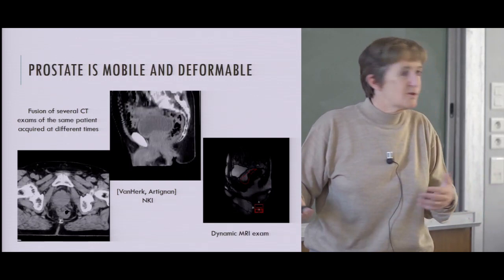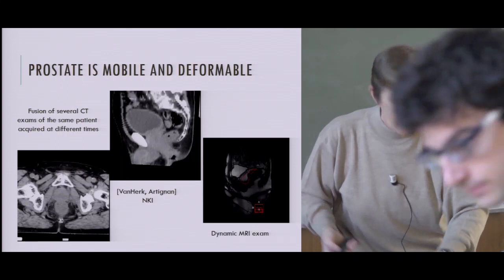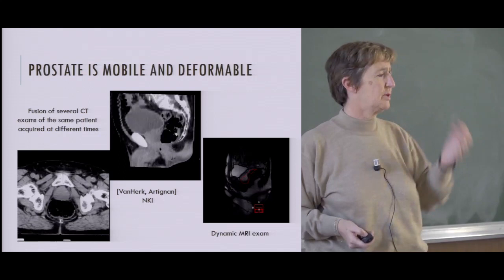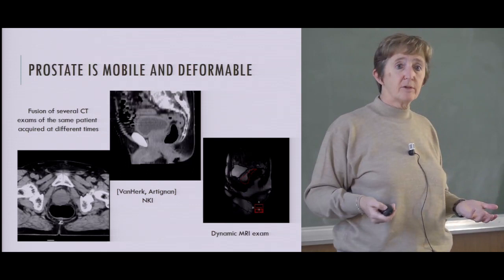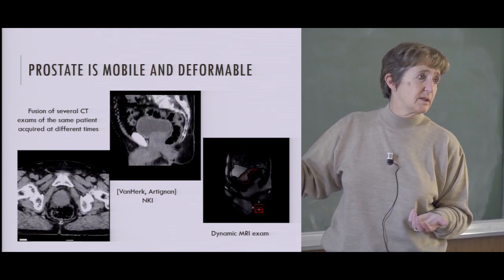But here it's from one session of radiotherapy to the following one, you have differences. And that's important because when they prepare the treatment for radiotherapy for prostate, they use the pelvic bones as a reference to position the patient. And so you see that if you do that, the pelvic bones are always at the same place, but the thing that you want to irradiate has moved from time to time. So you need another technique to do that.